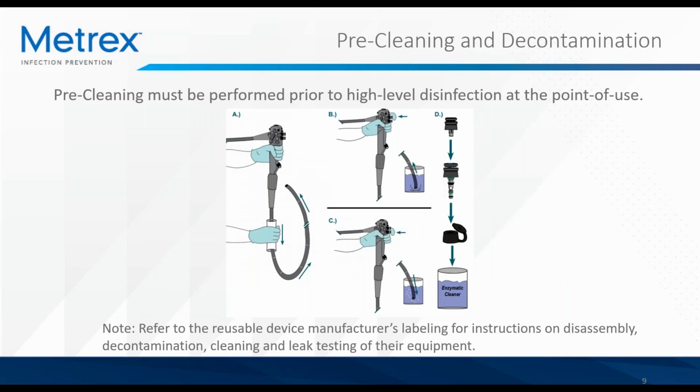Pre-cleaning is another important topic to discuss because pre-cleaning is necessary before any type of high-level disinfection. Improper pre-cleaning can actually hinder the disinfection process regardless of what high-level disinfectant solution you use. We at Metrex don't specify instructions for what your pre-cleaning process should look like, because that will vary drastically based on the devices you're disinfecting. So it's important to refer to the reusable device manufacturers' labeling for instructions on disassembly, decontamination, cleaning, and leak testing of their equipment.